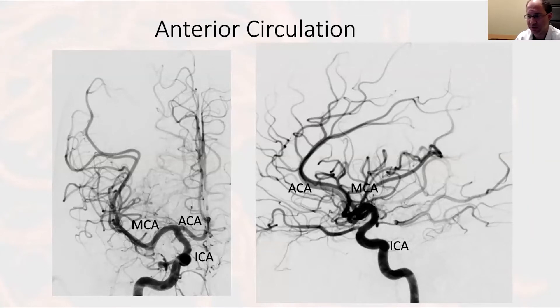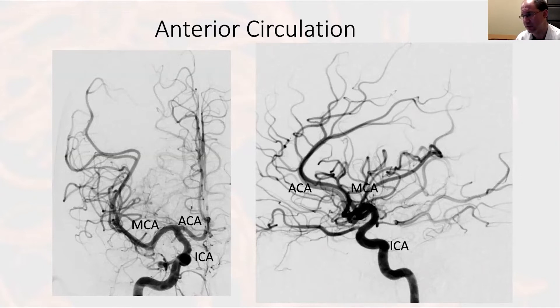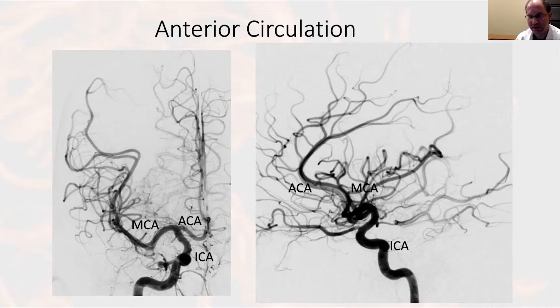This is an internal carotid artery injection. To our left is an AP view — not actually a coronal view, but a coronal plus axial view. To the right, we have a lateral view of the internal injection. You can see I've labeled the internal carotid, the MCA, and the ACA. You can see the bifurcation on the AP view a lot better than the lateral view, obviously.